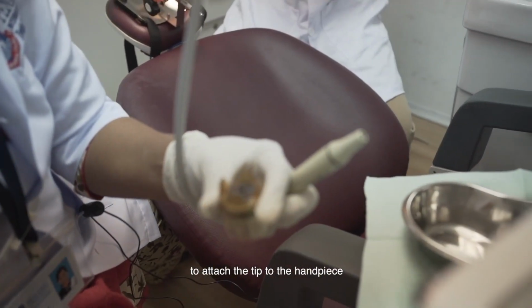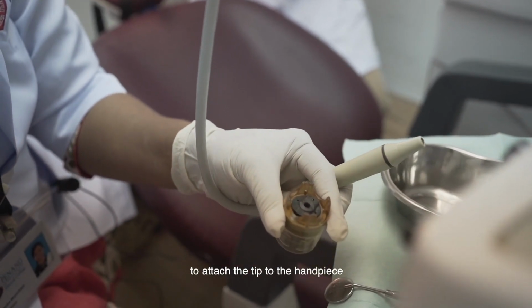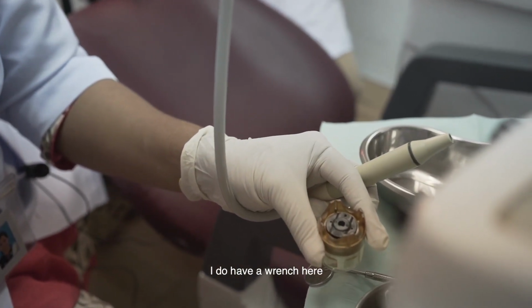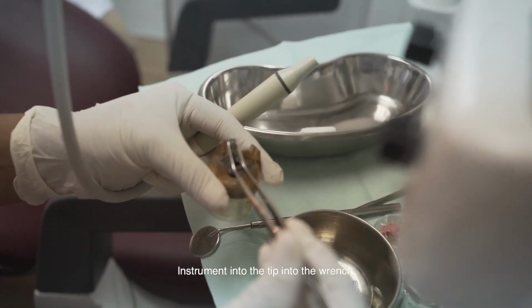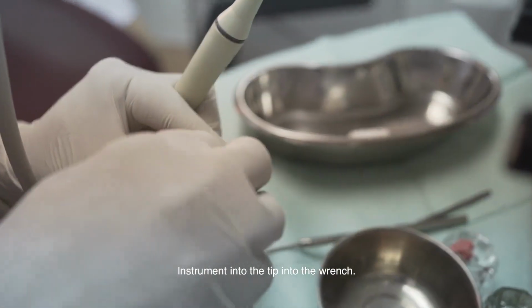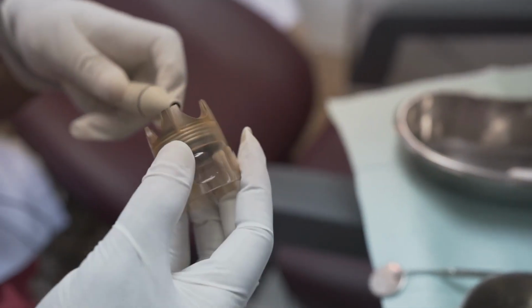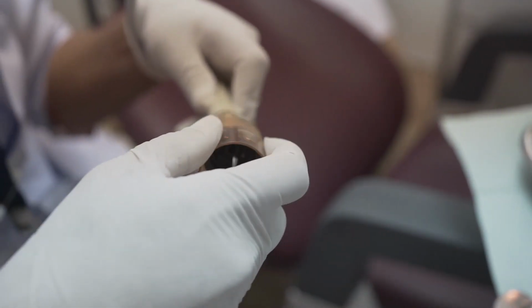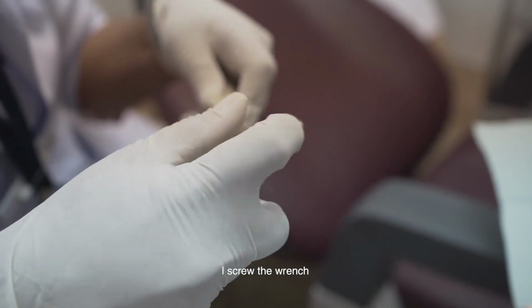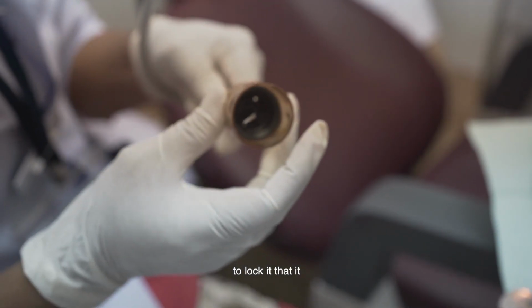To attach the tip to the handpiece, I have a wrench here, whereby I place my instrument into the wrench, and then I screw the wrench to lock it. That's it, one lock.